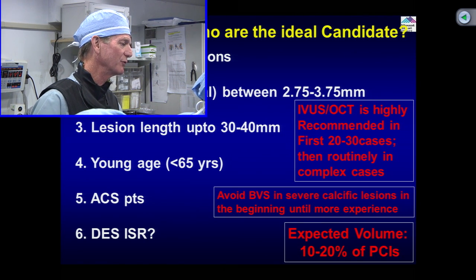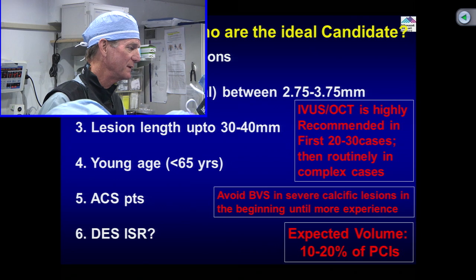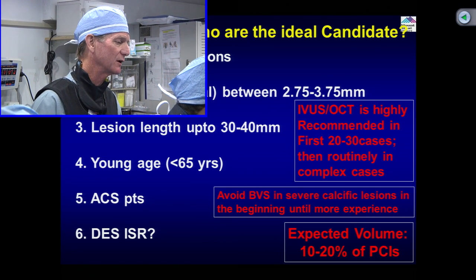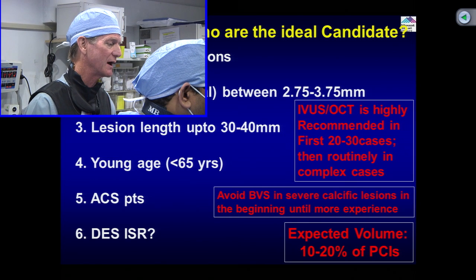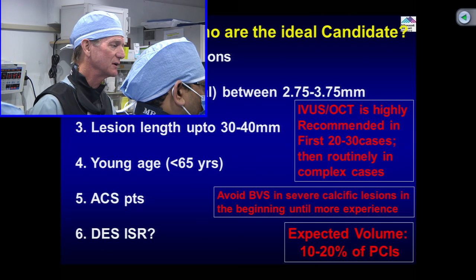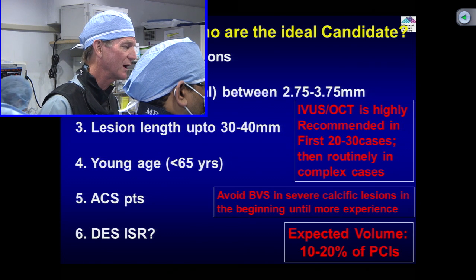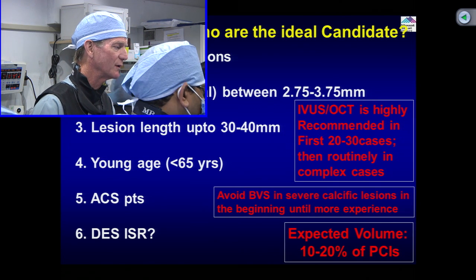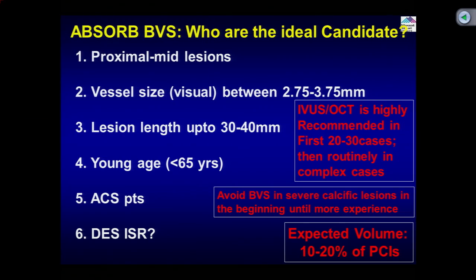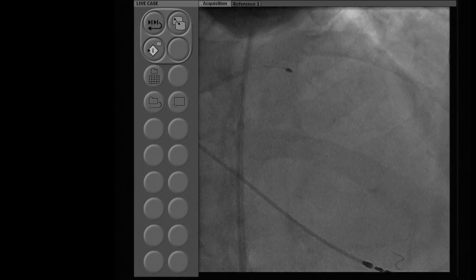Excellent. These are all forward-looking statements about what may be happening with STEMI with Absorb, but we do have a randomized trial, as you mentioned already, in almost 200 patients, head-to-head versus Xience, which shows that the OCT healing at 6 months is actually superior for Absorb compared to Xience. So all is pointing in the right direction for, I know, your passion, Samir, which is STEMI. Yes, absolutely. Samin, excellent review of the cases.